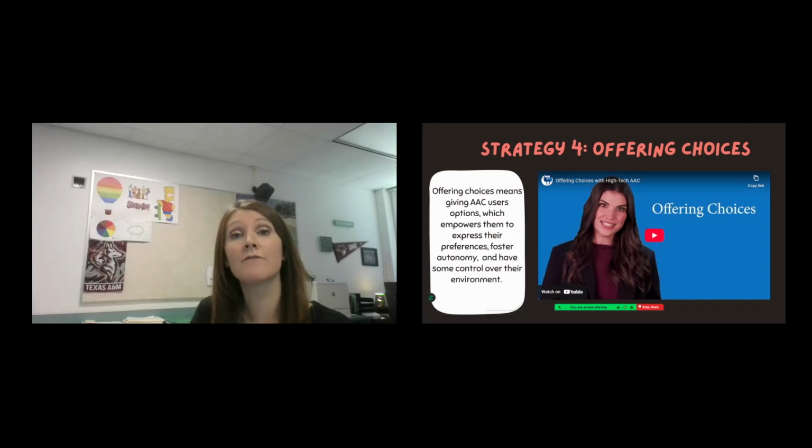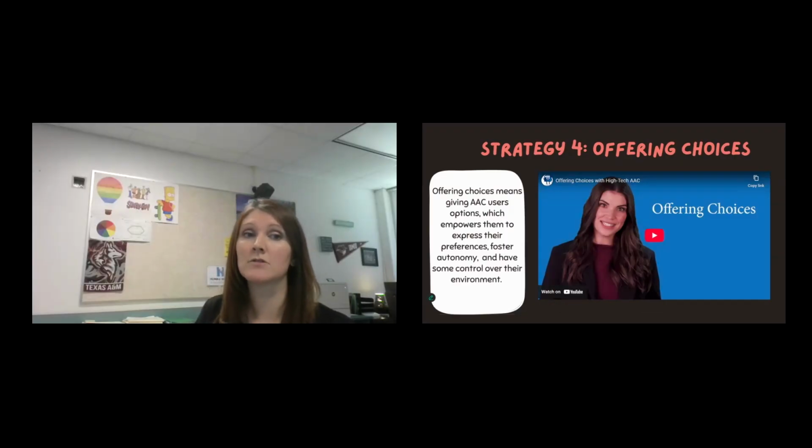Strategy 4 is offering choices. This is something I think that most special educators are pretty familiar with. Offering choices means that we're giving AAC users options, which empowers them to express their preferences, foster autonomy, and have some control over their environment.